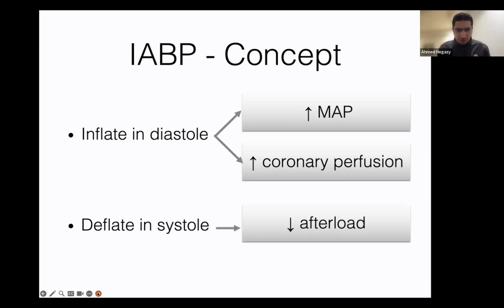That deflation at the onset of systole creates a bit of a vacuum effect. And all of a sudden, as the heart starts to beat forward, you get a deflation. That vacuum effect reduces your afterload.